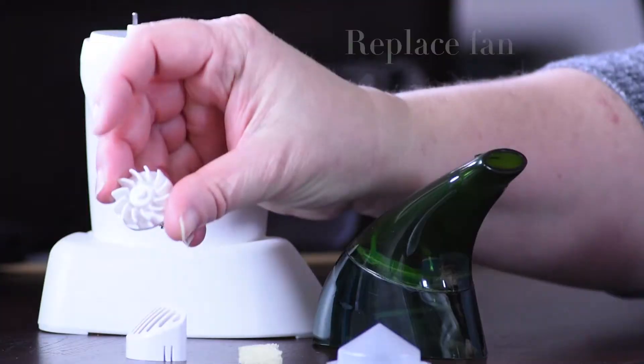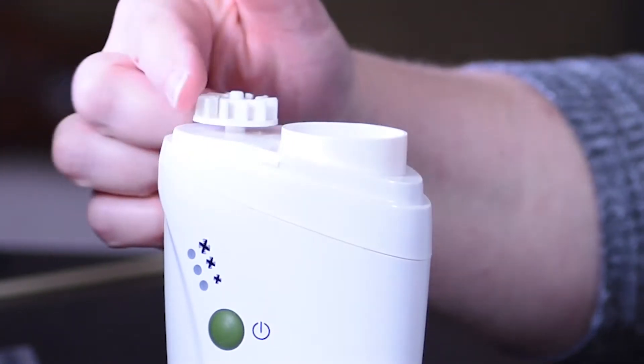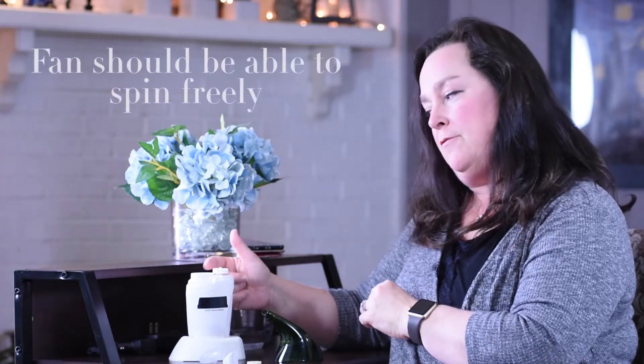The first thing you want to do is replace the fan. This little fan fits on this metal stub, just like so, and you should be able to spin it freely.